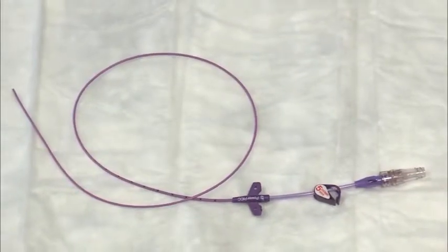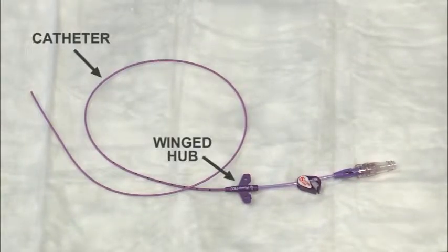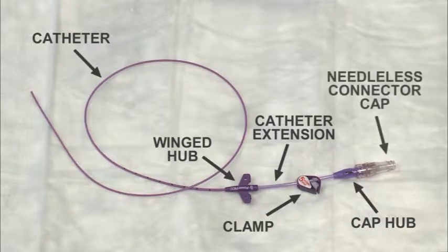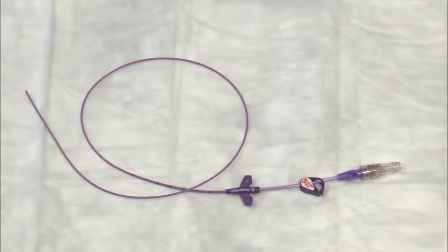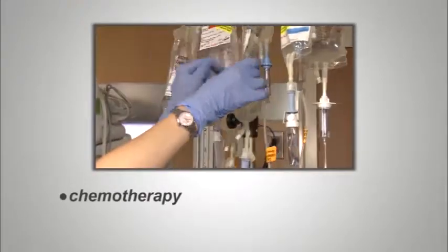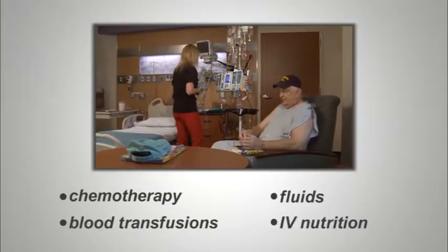All CVCs have the same basic parts: the catheter, the winged hub, the catheter extension, the clamp, the cap hub, and the needleless connector cap. As long as there are no problems, the catheter stays in place for the duration of the treatment. The CVC can be used to give different types of IV treatments. These include chemotherapy, blood transfusions, fluids, and IV nutrition.